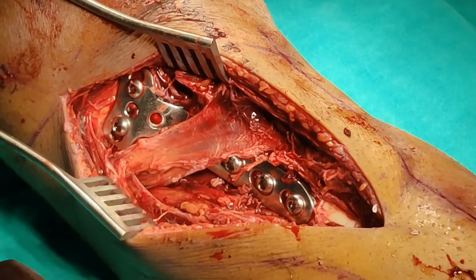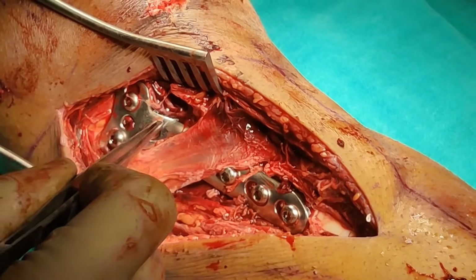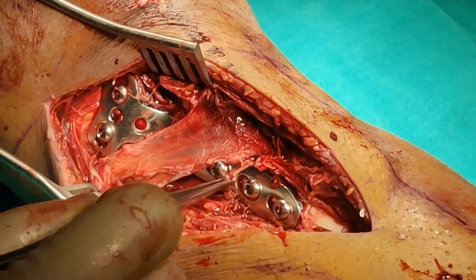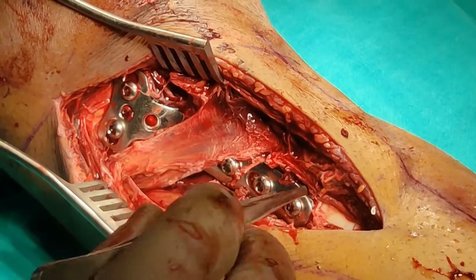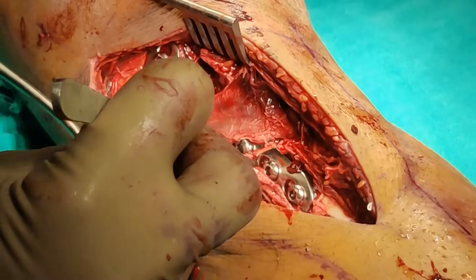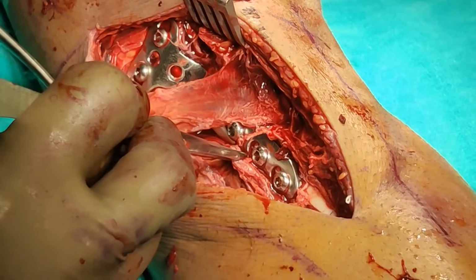So this is our final position. This is our T-plate. These two are partial threaded screws. These are fully threaded screws in buttress mode. Now it's just a matter of approximating these structures like this, and then I'm just going to use a Vicryl, and then we'll do a layered closure.